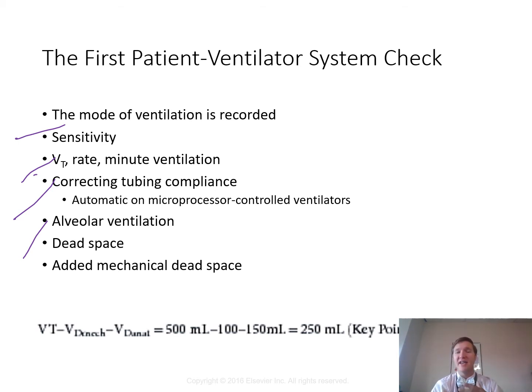So yes, we are adding dead space to it, but ultimately we might be about the same as them breathing through their oropharynx with how much we're adding to it. But because HMEs and other adapters add to mechanical dead space, the volume of these devices along with the patient's anatomical dead space must be subtracted from the tidal volume. So the more mechanical dead space there is, the more likely the patient is not getting their set tidal volume that we're hoping they're getting, right?